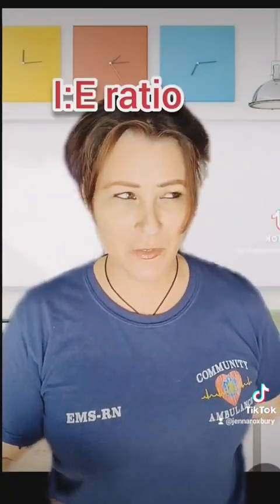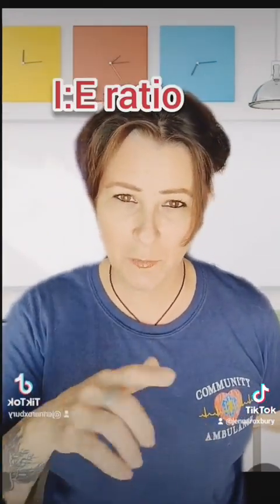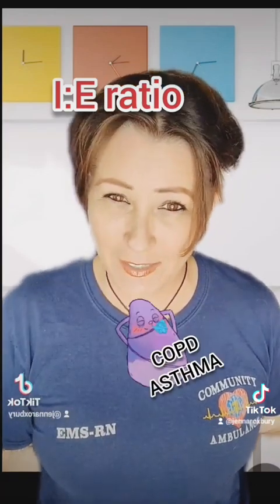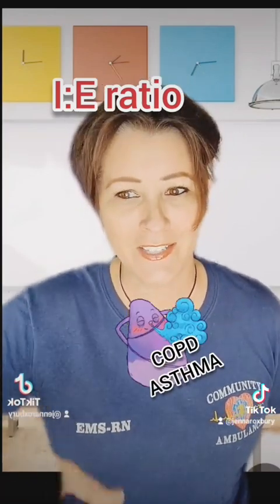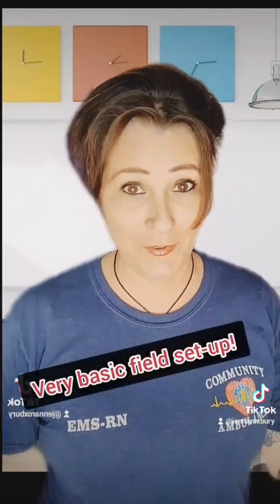So the IE ratio is the amount of time that you give them for inspiration and expiration. I normally set it to about 1 to 2 unless they have a disease process where they're air trapping, and then I tend to give them a longer expiratory time, so like maybe 1 to 4. This is the very, very basic way to set up a vent.